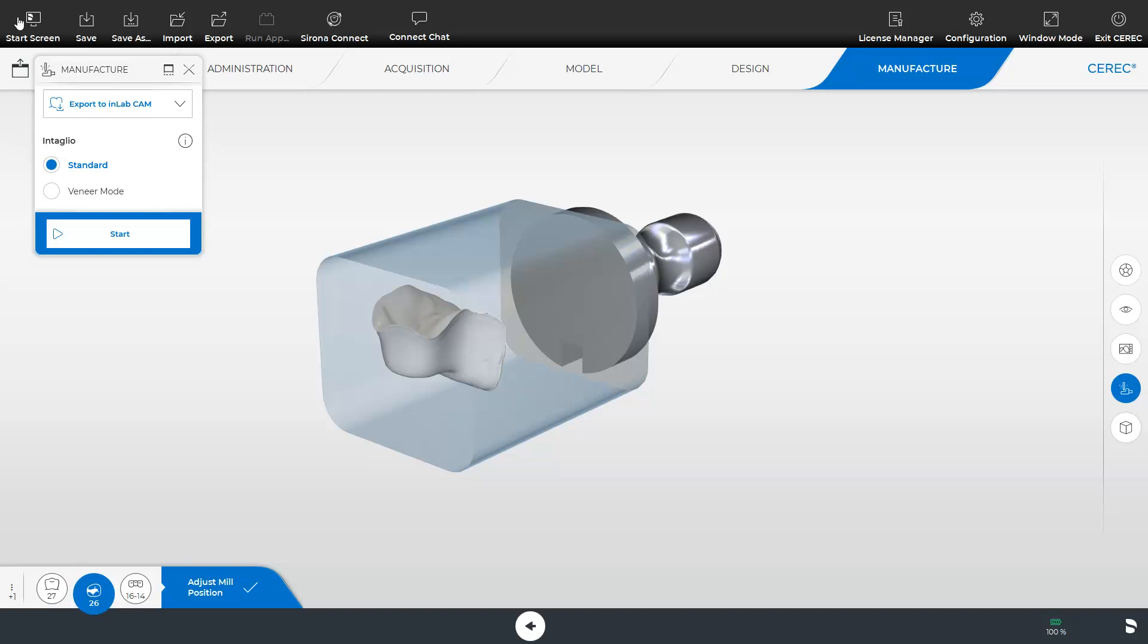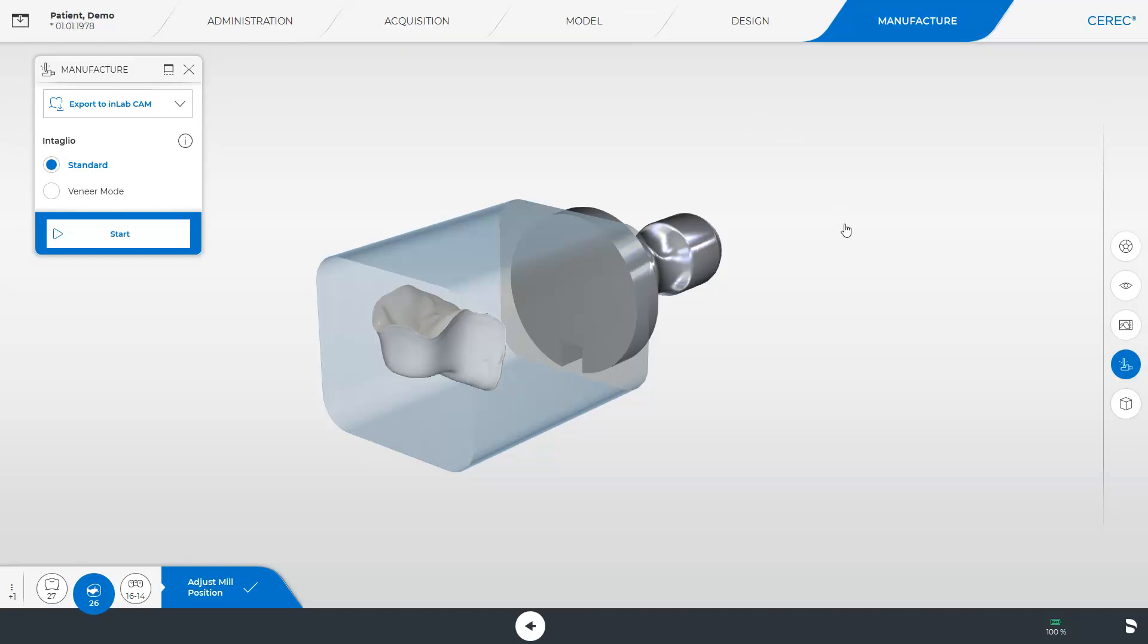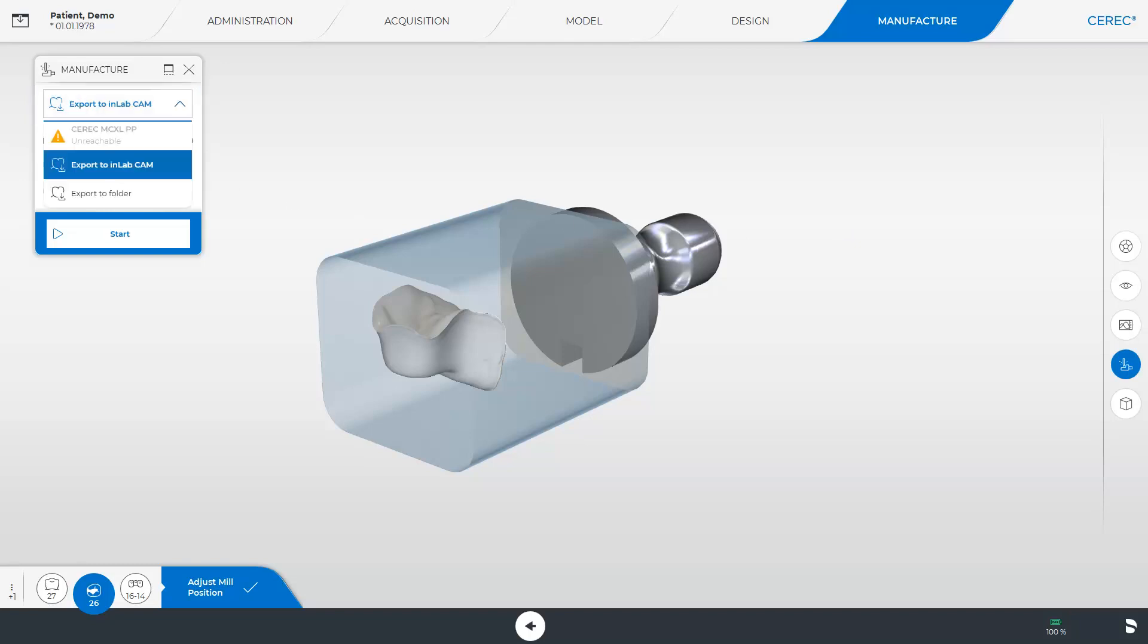We close the system menu and take a look at the last export option. For this to display, we tap the small down arrow in the window under Manufacture. A small drop-down menu opens. Here, we have three different export options. By tapping the first option, the restoration data would be sent to our CEREC MCXL milling unit.